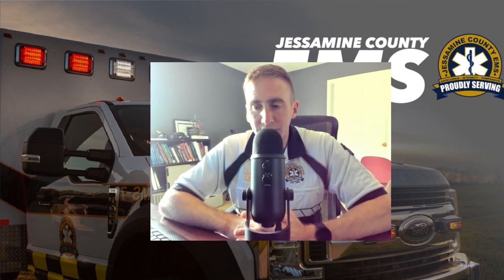All right, so is this going to be challenging logistically? Is it going to potentially tie up a supervisor vehicle for that time interval for that patient? The answer is yes, it is. Fortunately, these calls are usually uncommon. We have probably about a handful of these cases a year, about a handful of patients that would be a candidate for dual sequential external defibrillation.